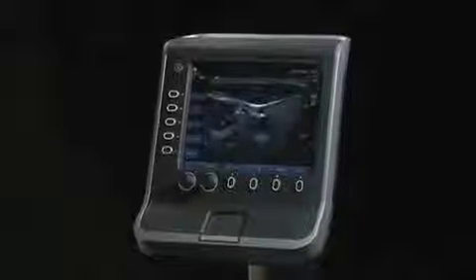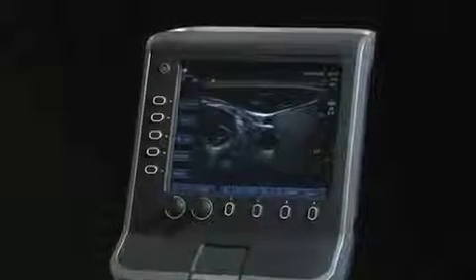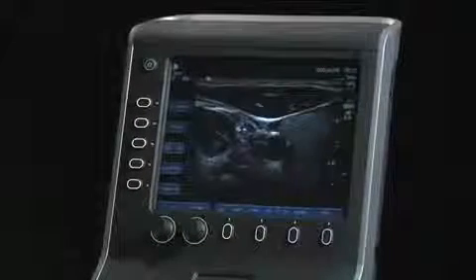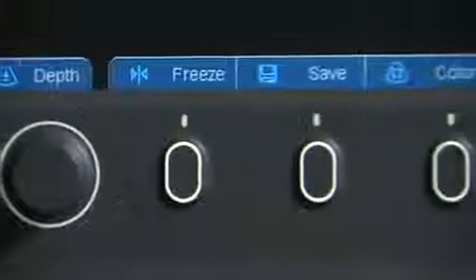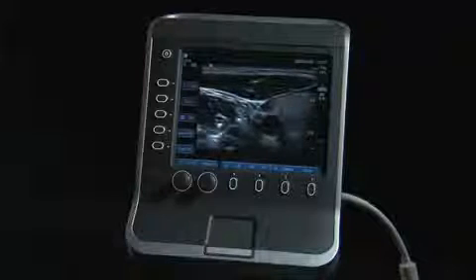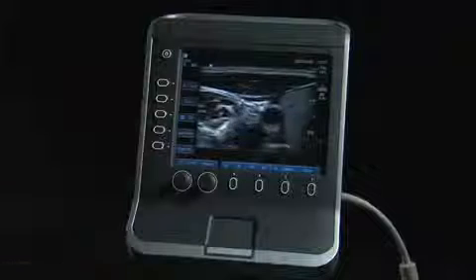The system control panel is simple to use. Many controls and features are automated to simplify the user interface and minimize the number of keys. The primary controls, or the controls used most often, are located along the bottom edge of the image display screen. The secondary controls are located along the left side of the ultrasound image display.